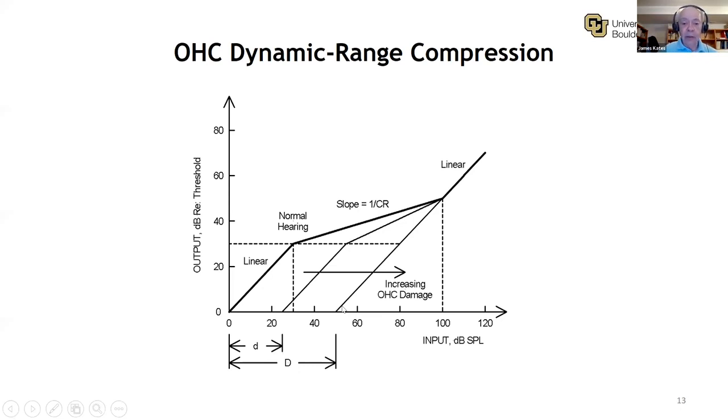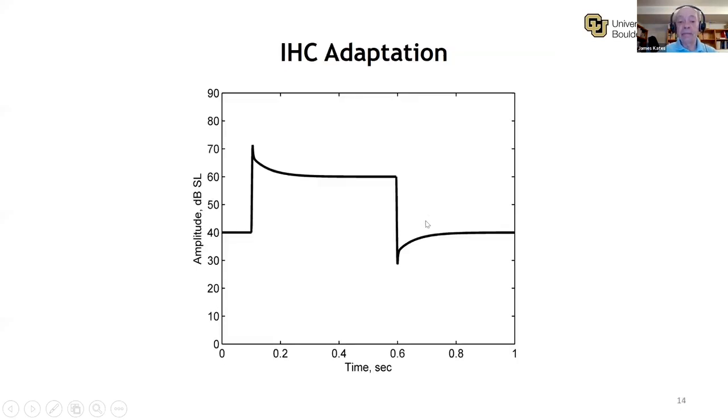amplifier. In talking about hearing loss, there's a term called recruitment, which is unusually rapid growth of loudness. And that's represented here by the straight line. As the signal increases, there's no compression to control that increase. It happens as fast as it can.